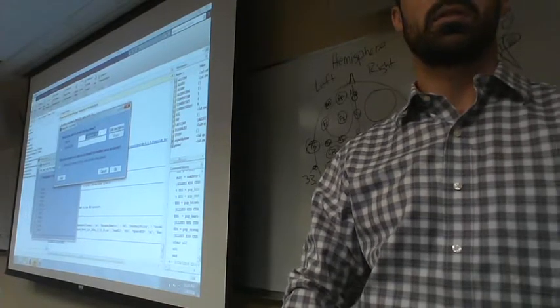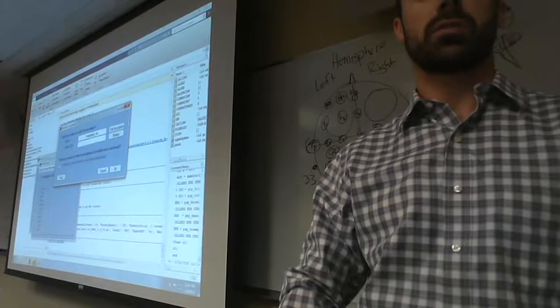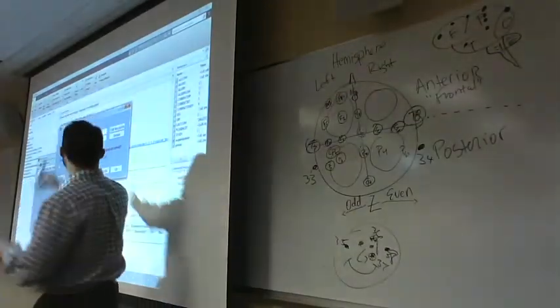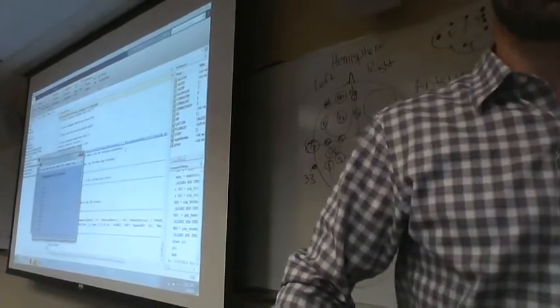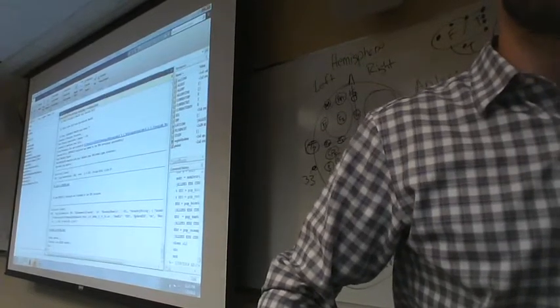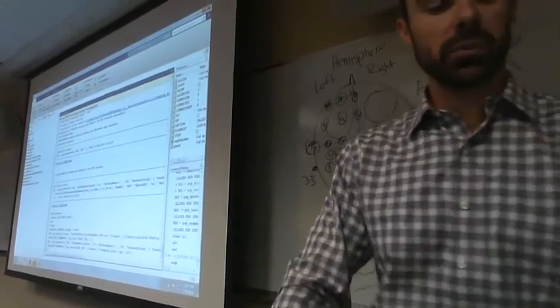Yeah. So, just like we normally do, I'm going to highlight this name and I'm going to save it. Check the box, paste it in here, and what we have here tells us this is an event list, e-list. It saves it there like that. And one thing we can do is come in here and type in EEGH again. And it'll show us what we did.